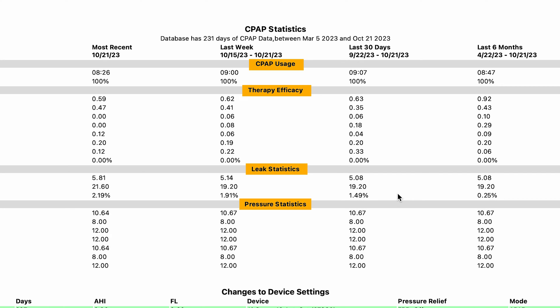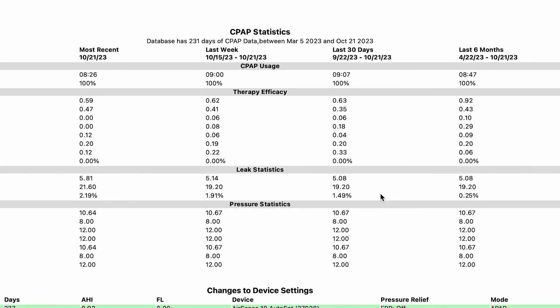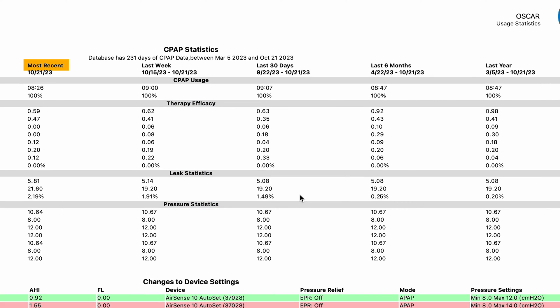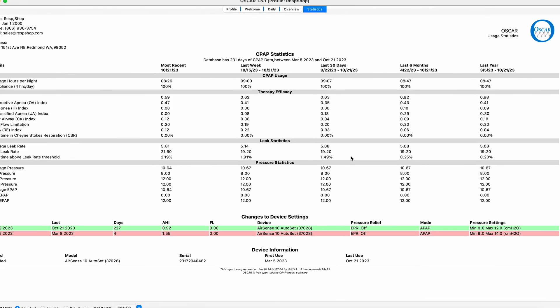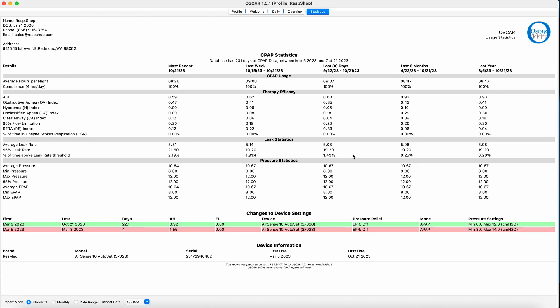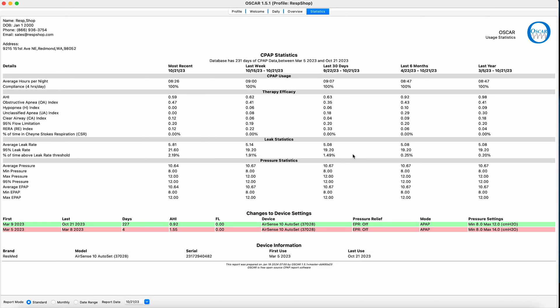These stats are totaled over five different time scales: Most recent, last week, last 30 days, last six months, and last year. This panel can be used to provide a quick snapshot of core data and how it is changed by comparing broad periods of use. Below this panel is one that shows dates when changes were made to your prescription settings, the number of days you've used those settings, and the AHI index during that period. This info can be helpful for evaluating the effectiveness of the changes made to those settings.